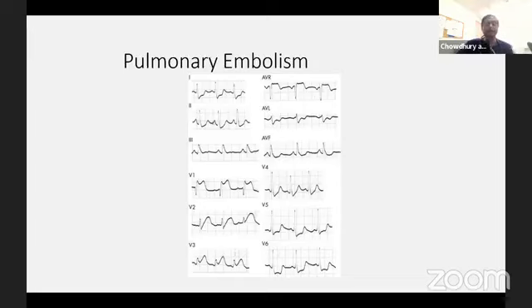Pulmonary embolism, I would tell you not to worry about ST elevation. Pulmonary embolism giving ST elevation is extremely rare, but with sinus tachycardia and hypoxia, we should have some idea, and bedside echo can be helpful. Rarely it can give you right bundle branch block, and also precordial V1, V2 ST elevation.